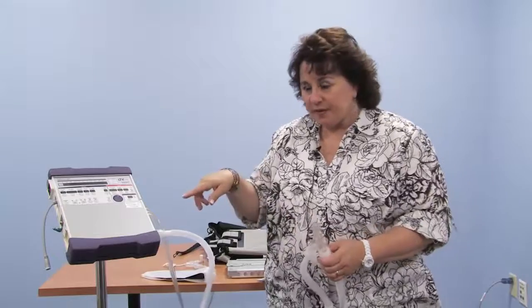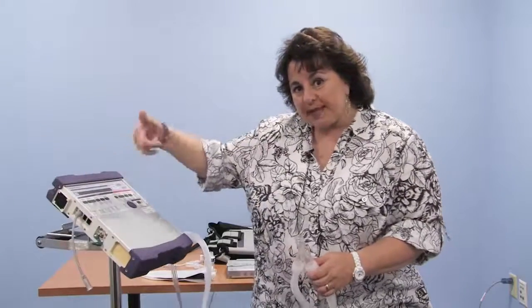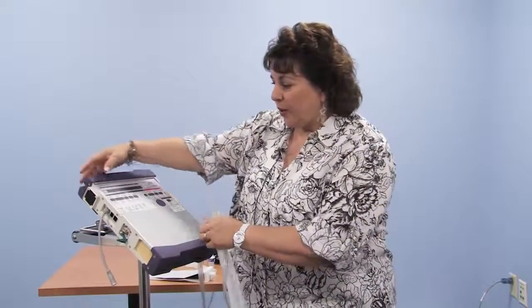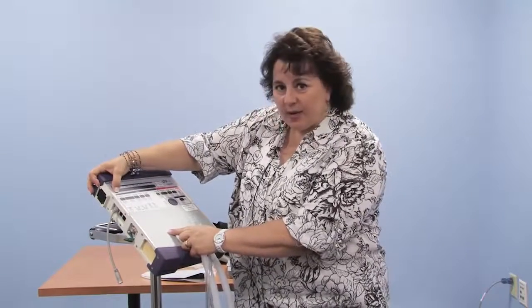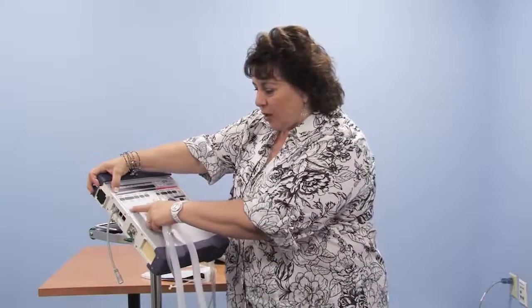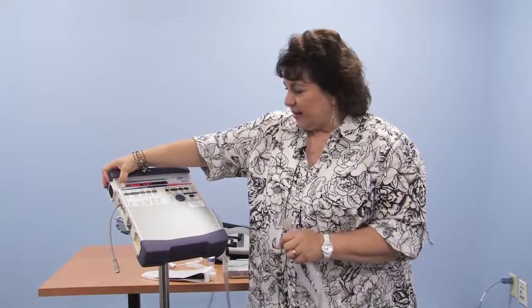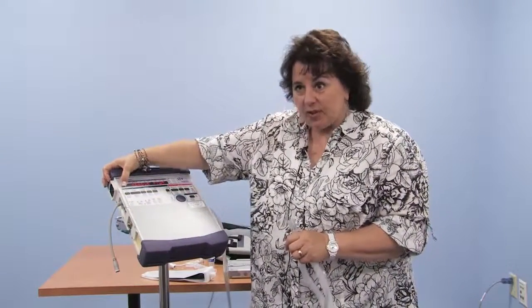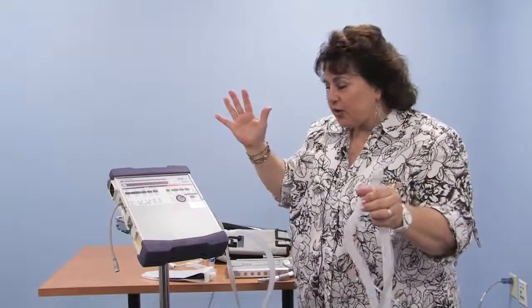There is a pre-use test, a tightness test for the device. It is in the manual and it should be taught to you. And I'll just explain it as we do it. We hold down the select button up in the window. Hold it down, don't let it go. Hit the on button. We wait until it says remove patient. Okay, remove patient. We don't have it on our child. We can't do that on our child.